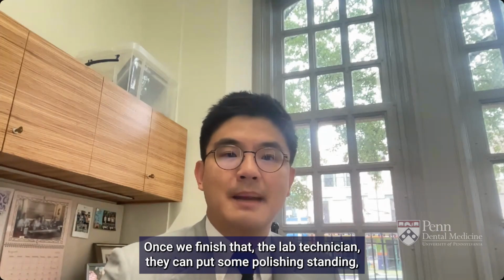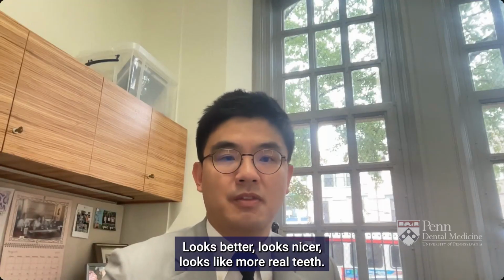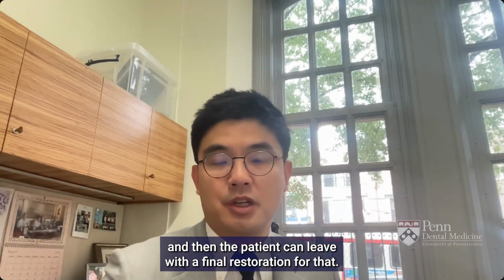Once we finish that, the lab technician can do some polishing, staining, to make the tooth look better and nicer, like more real teeth. They can stain, glaze, and cement, and then the patient can leave with a finished final restoration.